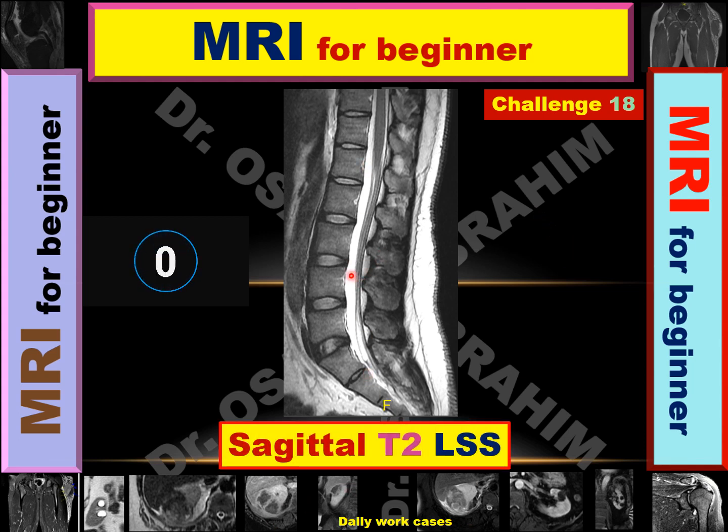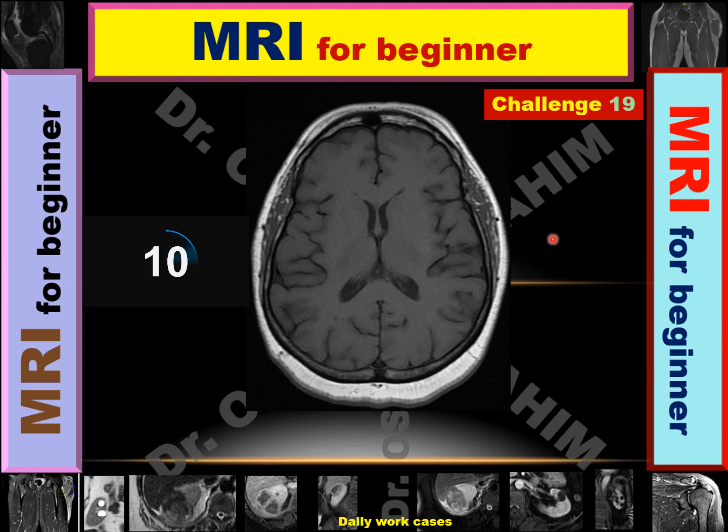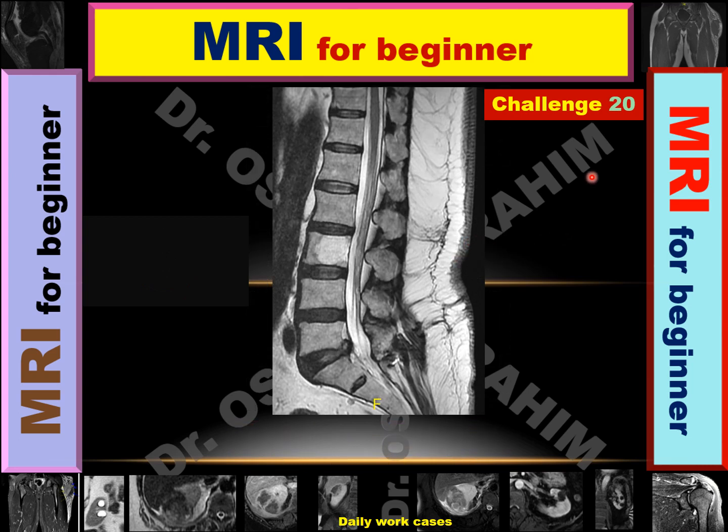Sagittal T2 lumbosacral spine. Challenge 19. Axial T1 brain. Examined part is the brain. Last challenge.